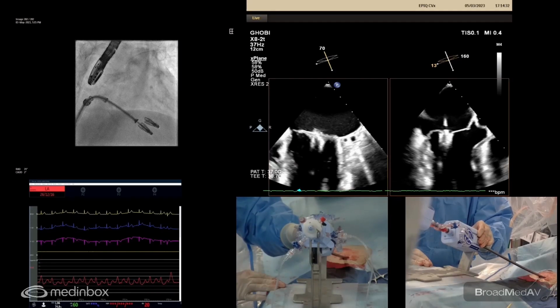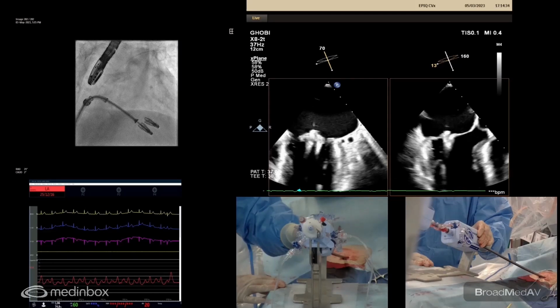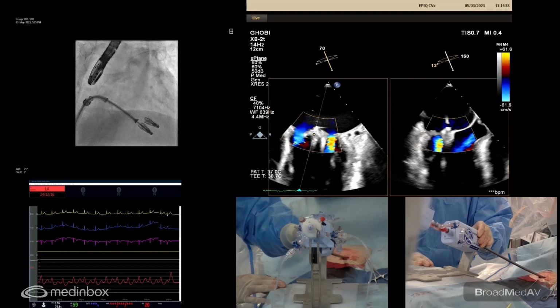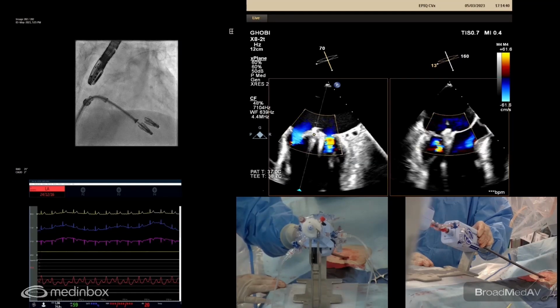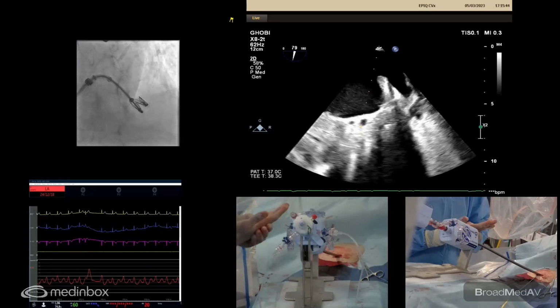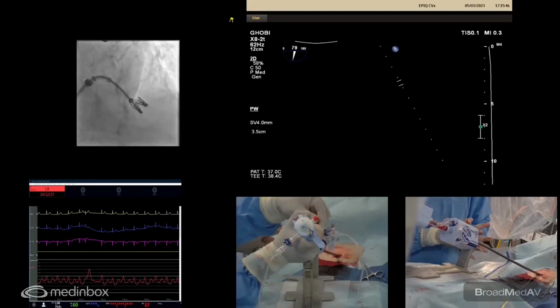And you want to see a color? So if you were causing stenosis, you'd see an increase in your LA pressure, right? Exactly. That's the advantage of recording the LA pressure. You can see, and look at that. We just have a small lateral jet, and the medial jet is gone. Great. And the LA pressure is 17. We started with 27. So I think we're ready to go.